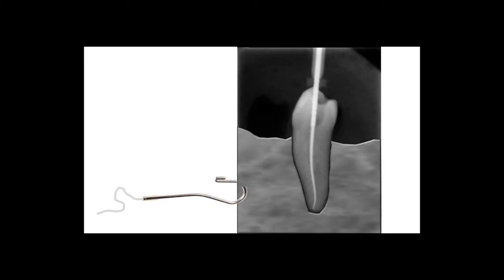So when we're talking about capacitor plates in endodontics, and specifically with electronic apex locators, our plates are actually the file itself, then the periodontal ligament and supporting structures. So if you can, in your head, imagine that these two, instead of a file and periodontal ligament and bone, are rather two capacitor plates, then the concepts will become a little bit easier to understand.